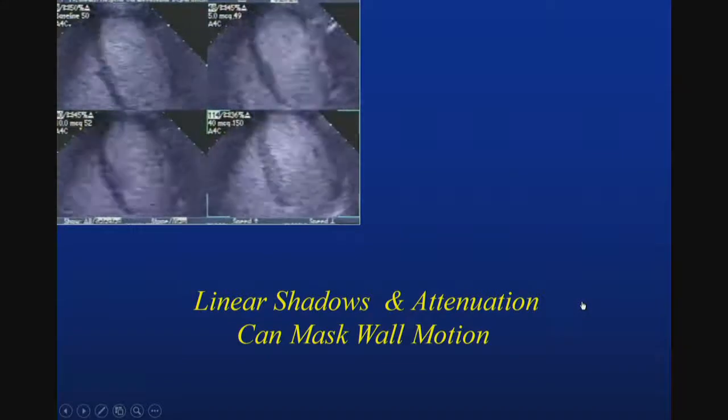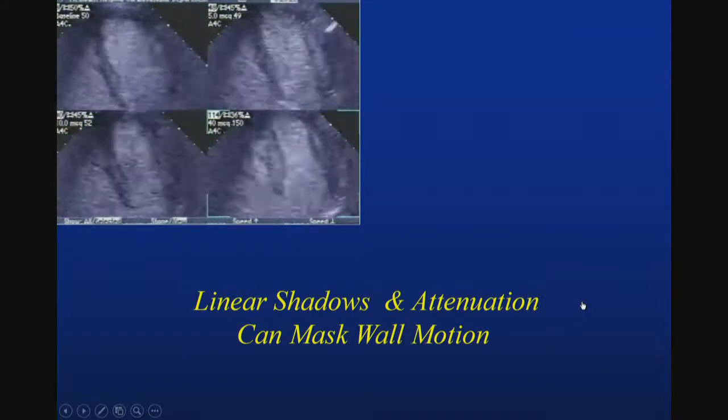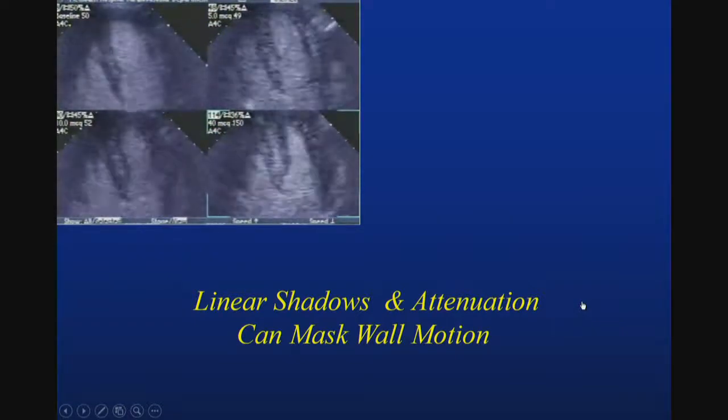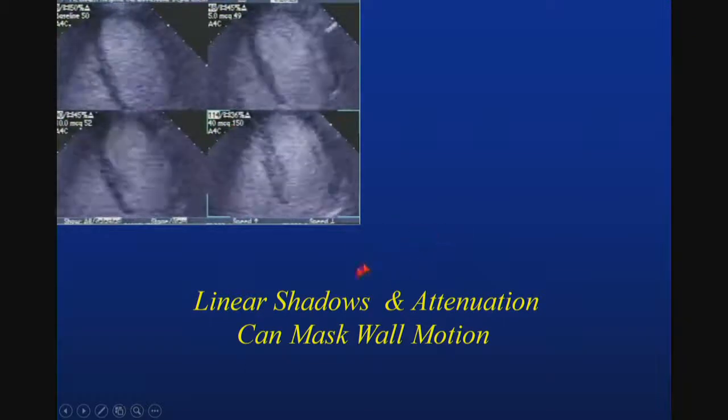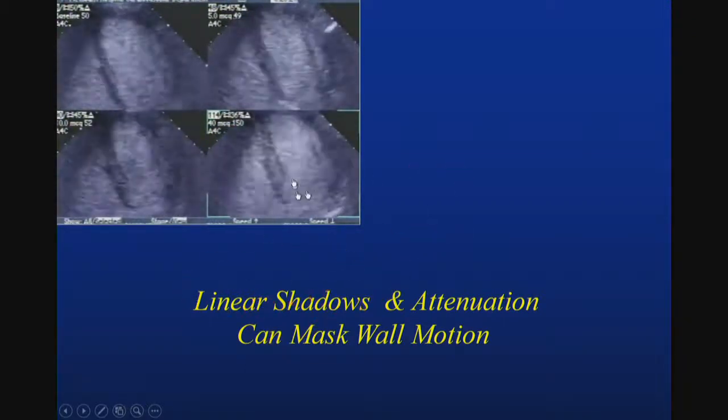And the reason I mentioned that: don't use contrast all the time. And I think in our experience, you'll find out it's about maybe 60%, 70% of the time, et cetera. You also have to be careful about some of the artifacts that you may see with contrast.